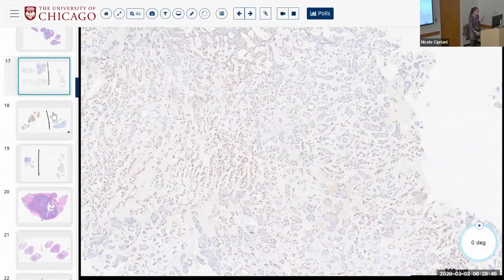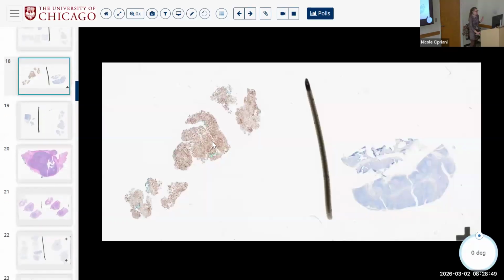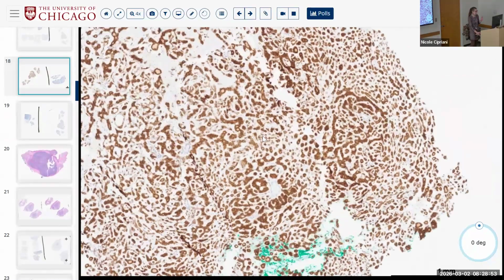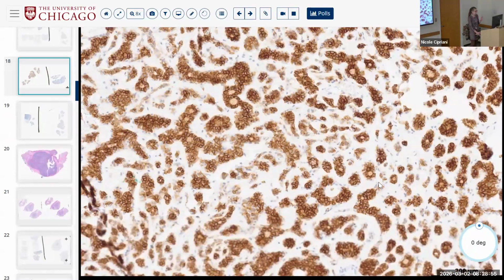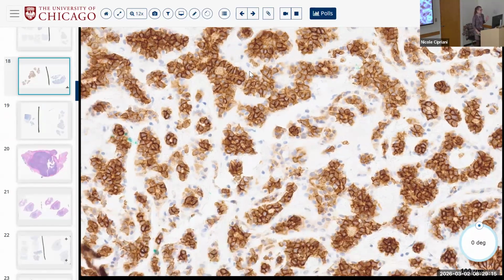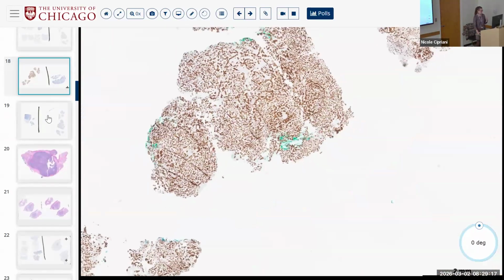You're morphologically in a position where this looks a lot like adenoid cystic, but I know that pleomorphic adenomas can have those types of areas. CD117 is ridiculously strong in the epithelial compartment. So when you read about CD117, yes, it's strongly positive in the epithelial cells of adenoid cystic, but like we saw and will see continually, it is also equally strong in the epithelial cells of non-adenoid cystics. So don't let c-KIT drive you to only adenoid cystic.